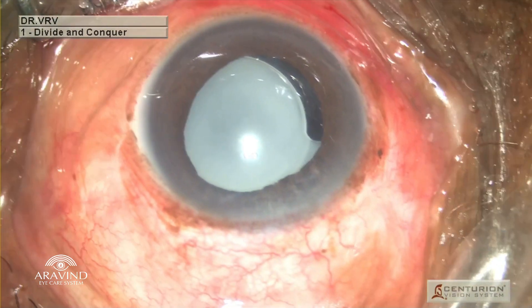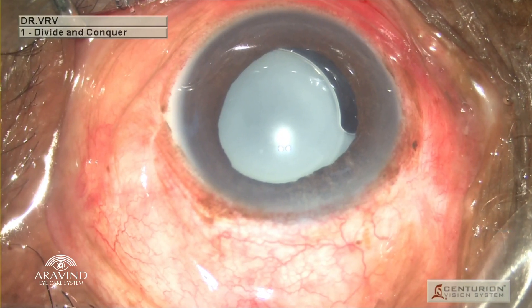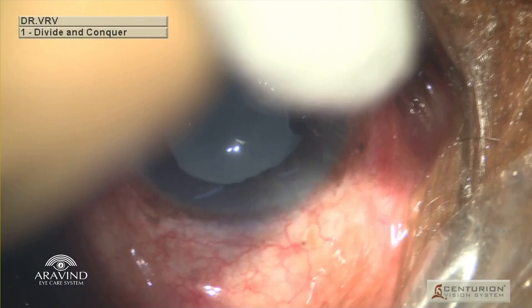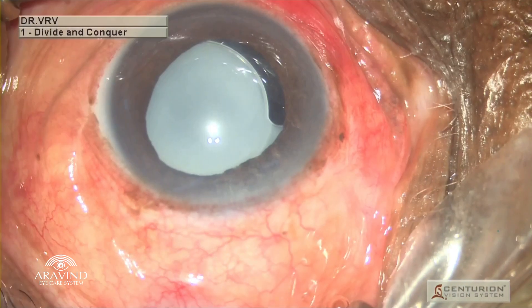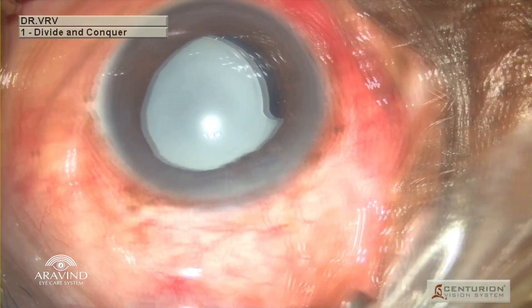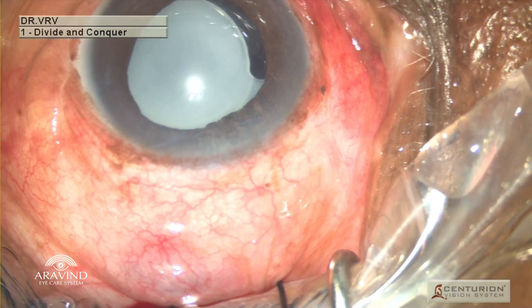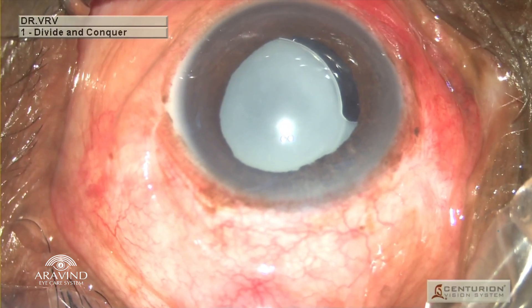This is a 75-year-old male patient who presented with complaints of dimness of vision in the right eye for two years. He gives history of right eye cataract surgery done outside seven years back. The visual acuity was one by sixty. On slit lamp examination, an opacified intraocular lens was seen, and so an IOL exchange was planned. The patient had opted for a PMMA lens.